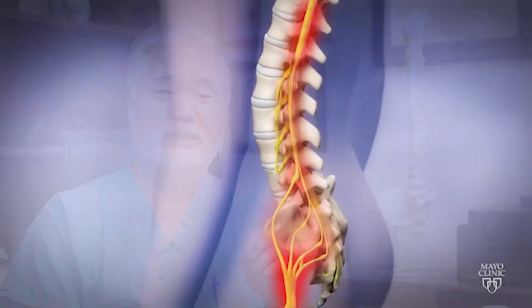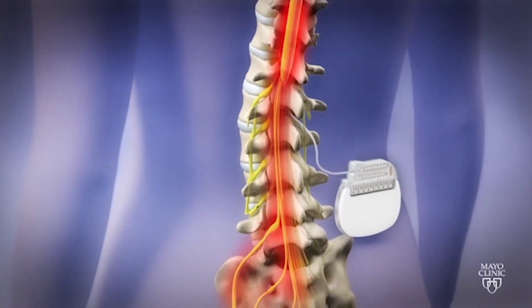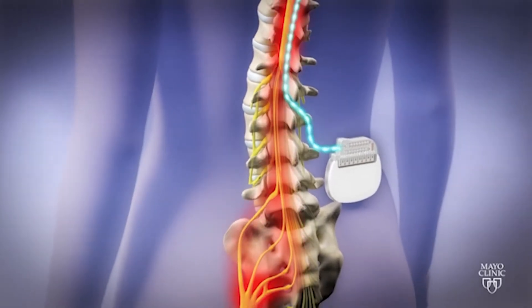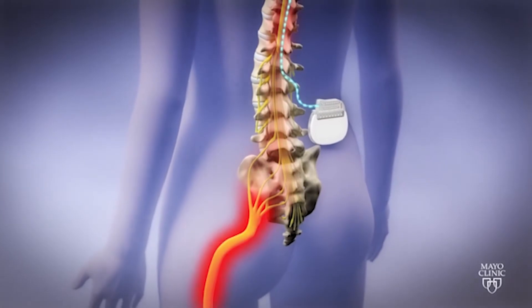A spinal cord stimulator simply involves placing a very small electrical wire electrode into the spinal area to interfere with any kind of pain coming from the lumbar lower back or leg that is reaching the brain. Such stimulation can also induce secretion of pain-relieving hormones such as endorphins and enkephalins at the spinal cord level to relieve pain.